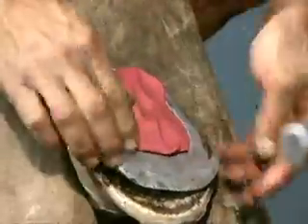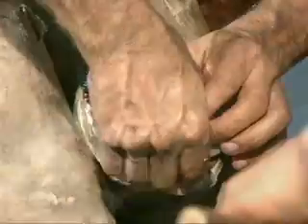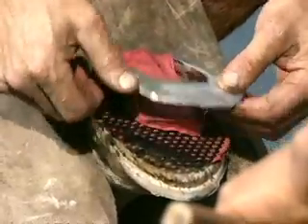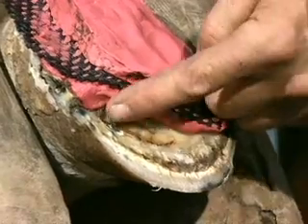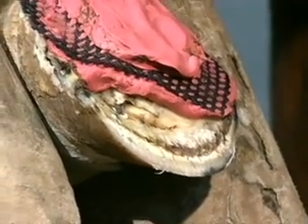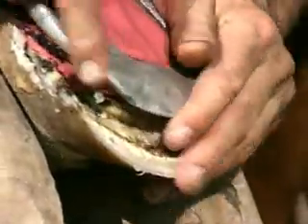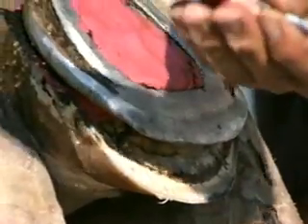Push it down quite hard. Push the advanced cushion slightly under the lip of the shoe. I'm using the same shoe that this mare came in with — I'm just setting it in a different position. You can actually feel underneath. Trim your screen off. There's the draining abscess — we do not want to cover that area up; we'd like to be able to treat that. The shoe, once again, is acting as a hospital plate because it's directly beneath the toe of the shoe.